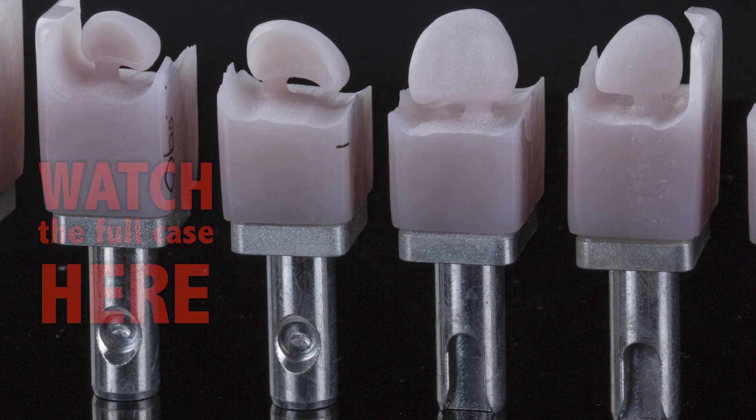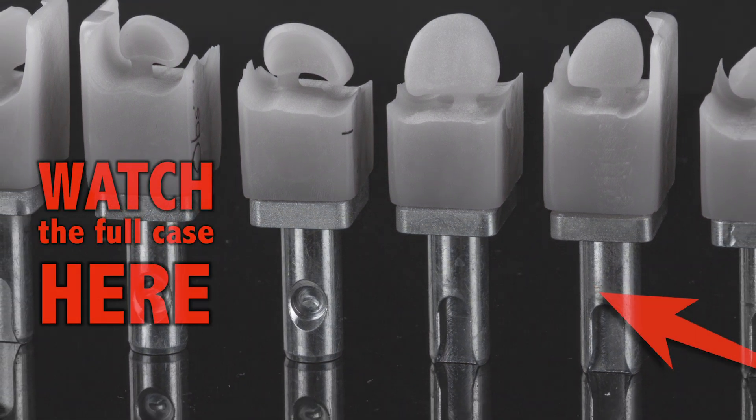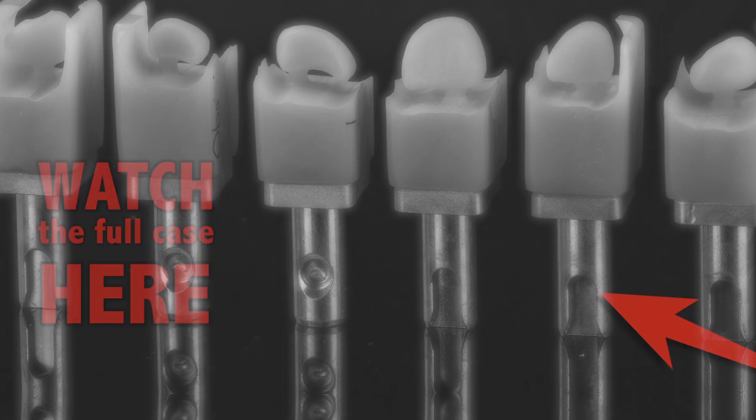Each restoration takes about 15 minutes to mill and then requires a crystallization cycle in the final stage porcelain oven for 25 minutes.